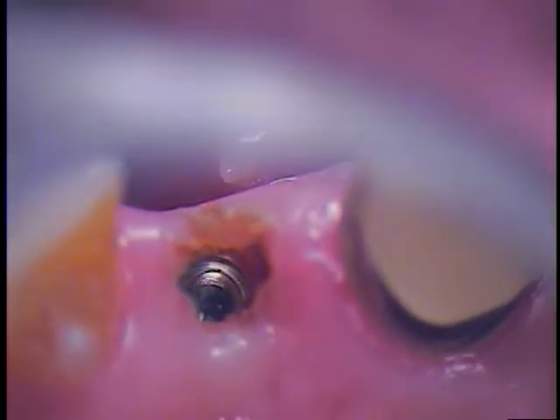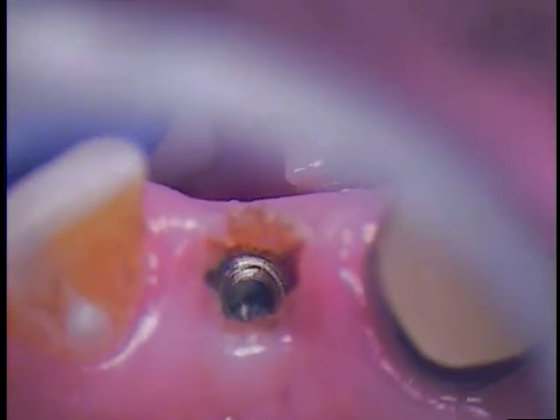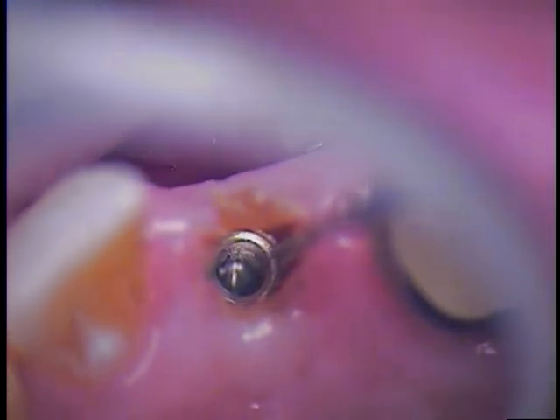Okay, we still have to look for that sleeve. If it's there, it's there. If it's not there, how do you find it? You take your explorer and just kind of wiggle a little bit. It might be attached. Or we may leave it. We'll see. Sometimes you leave well enough alone. Okay. That little piece is gone now.